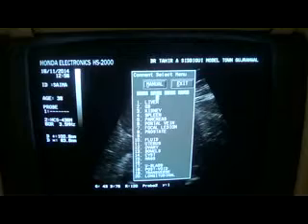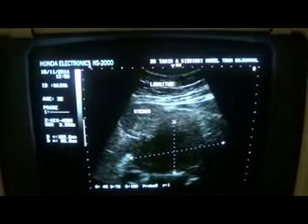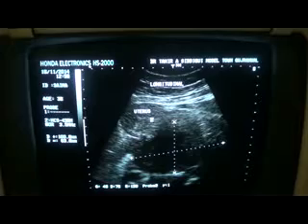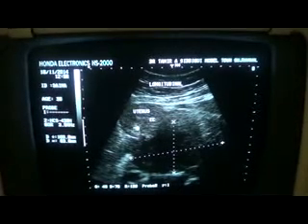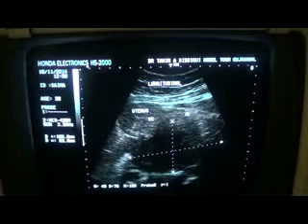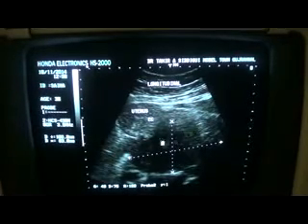This is the longitudinal section of the uterus, and this is the endometrial canal. This white line that you are seeing is that of the endometrial canal, in early proliferative phase. This is the fundus of the uterus, anterior myometrium, posterior myometrium. However, from here onwards, the thickness of the anterior myometrium is compromised.